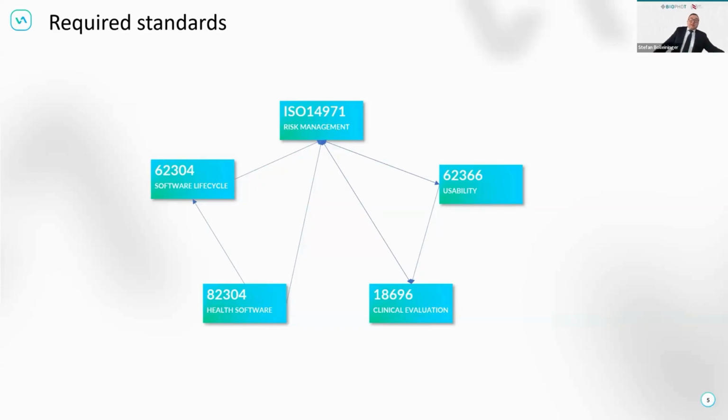Okay. That's a pretty interesting question. What if an AI software is offering curiosity insights, no claims, no prediction, but is marketed to doctors and clinics for them to offer to patients if they feel that it might be appropriate to help with patient compliance, educating the patients? Does it make it a medical device? Can you give one or two lines more about what curiosity insights are, and a little more about the circumstances, because education of the patient can be achieved by Google as well, so that's not a medical device.